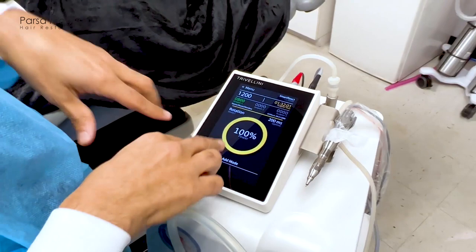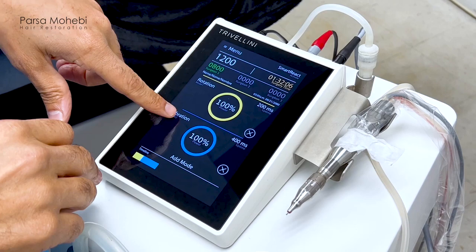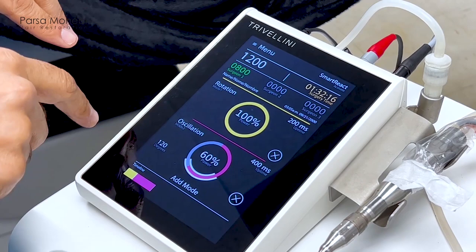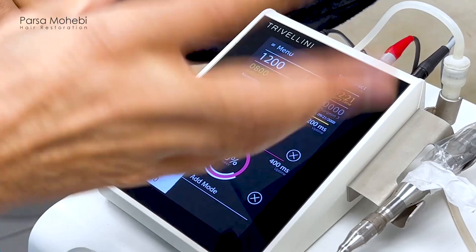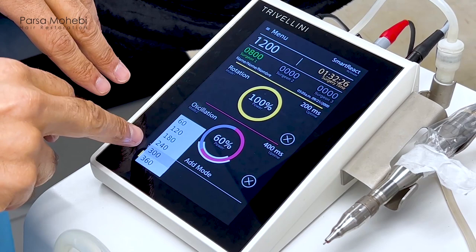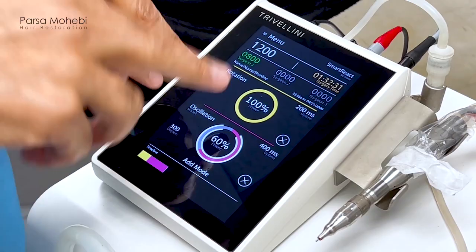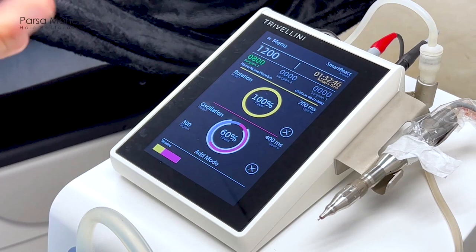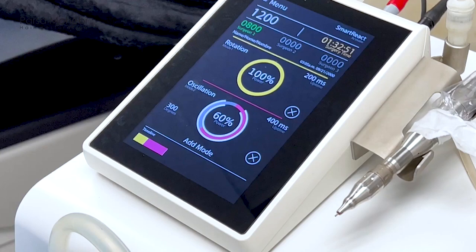We switch to something else and add the second mode as oscillation. We have control over the power of the machine — how fast we want the machine to go back and forth. In this case, we put it at 60% power and set the oscillation degree to 300 degrees. So we're going 300 degrees back and forth with lower energy. That's a very safe mode for the deep layers of the skin to liberate the follicular units without damaging the follicles.